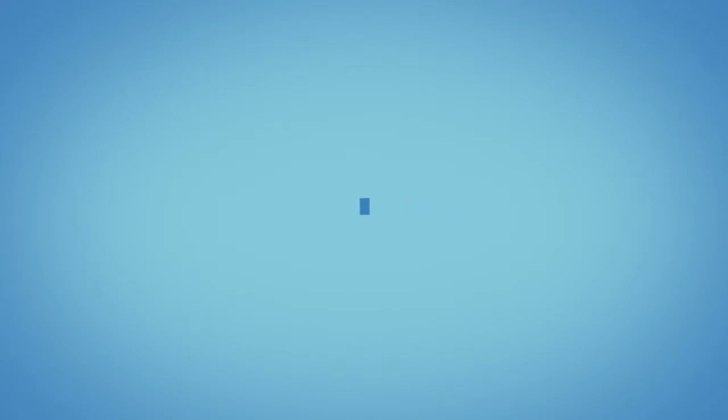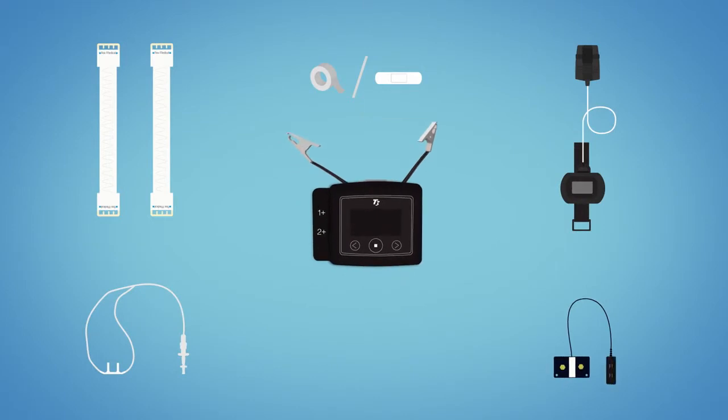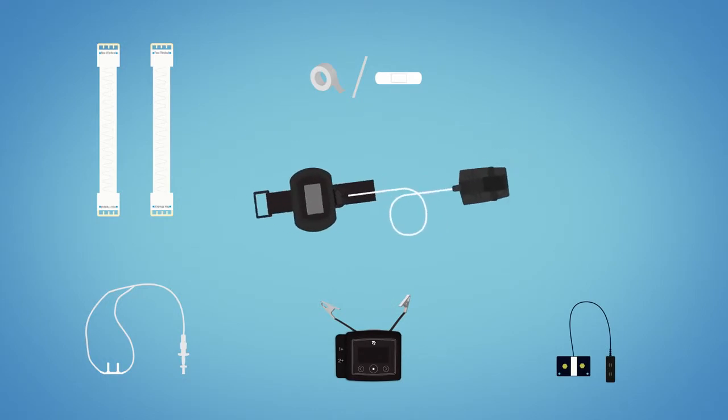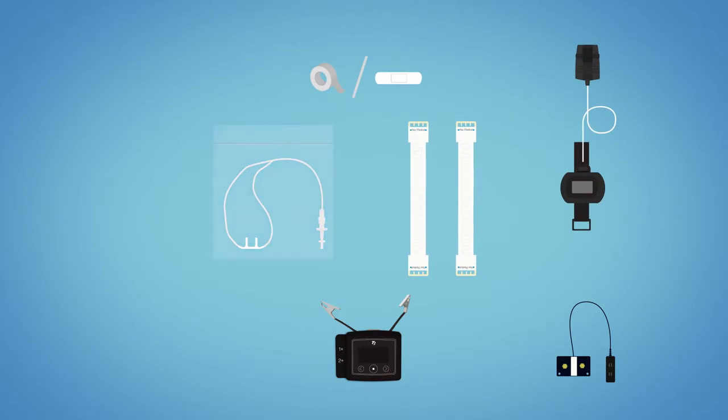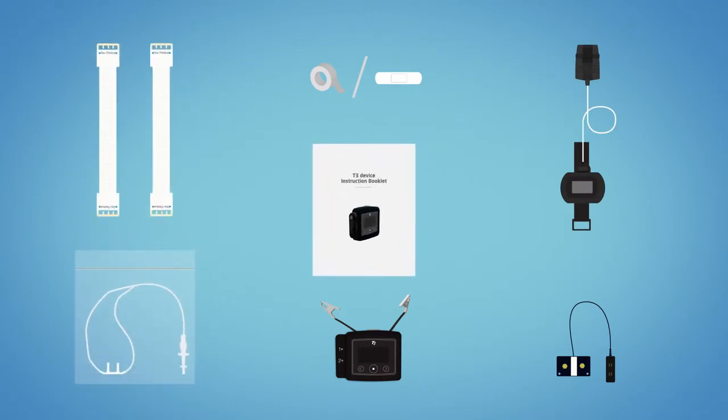Unpacking your kit. When you receive your home sleep testing kit, please check the kit contents to ensure you've received all the necessary parts. The contents include the T3 home sleep testing device with the abdomen cable attached, the wrist oximeter and velcro strap with the oximeter probe attached, two belts and a nasal cannula in a sealed plastic bag, and an instruction booklet. Your kit may also contain tape or band-aids to help secure some of the sensors.